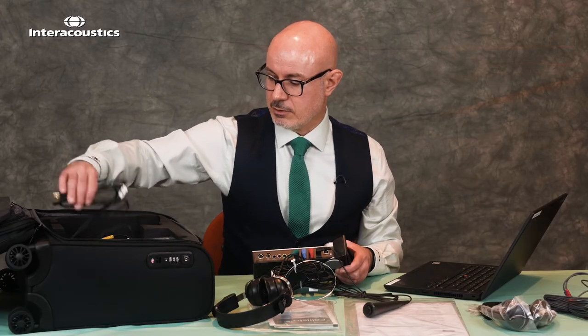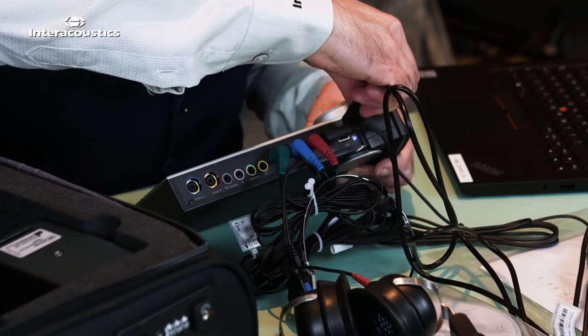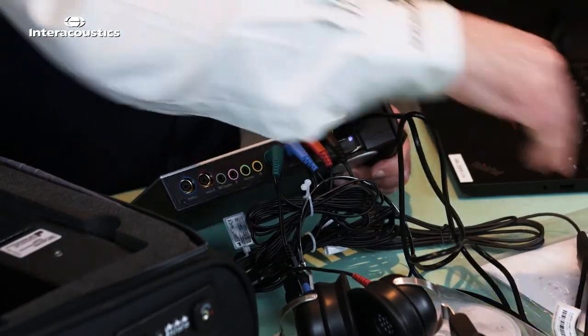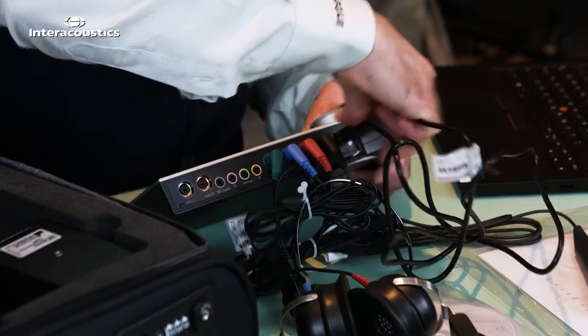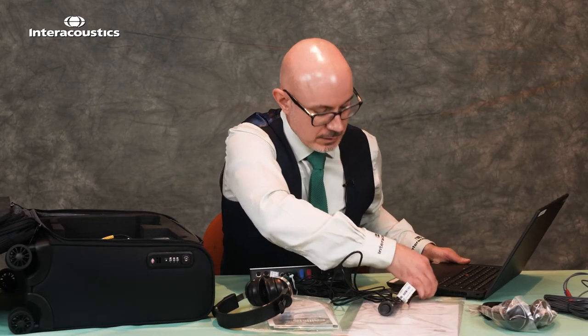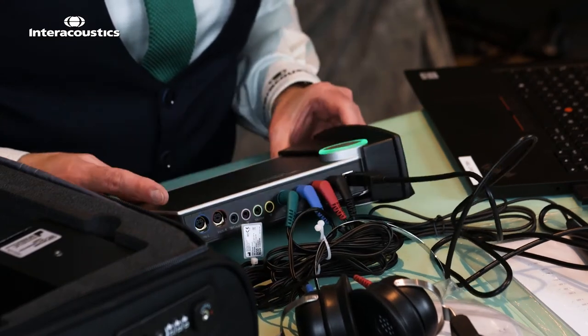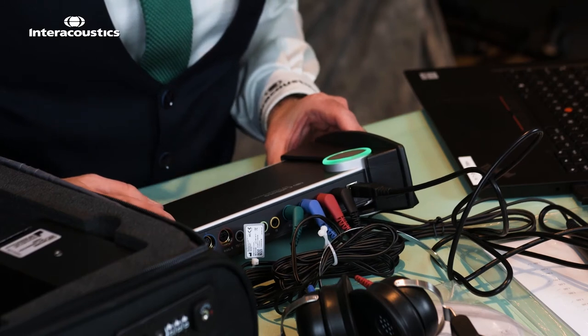To connect to the laptop we can take our USB cable, first connecting it into the Callisto and then into your USB port on your laptop. Once successfully connected you'll see the green light illuminate as the Callisto takes power via the laptop.